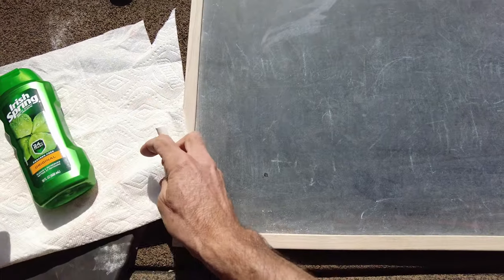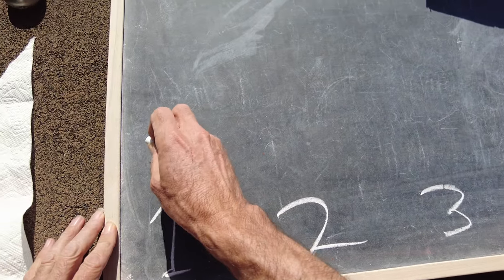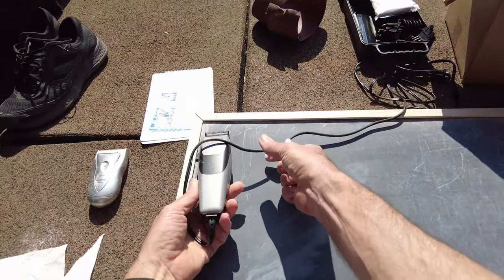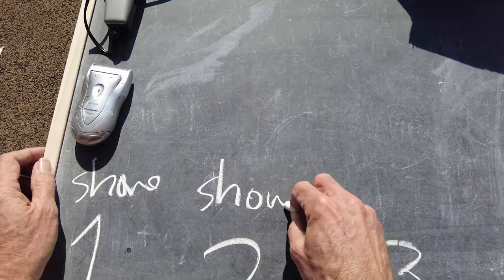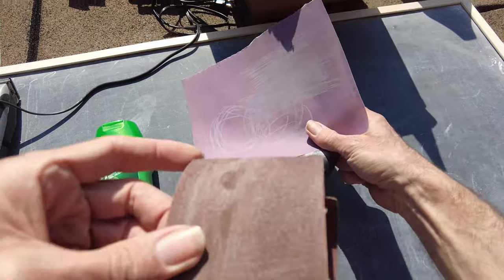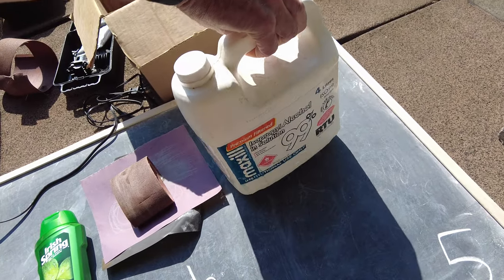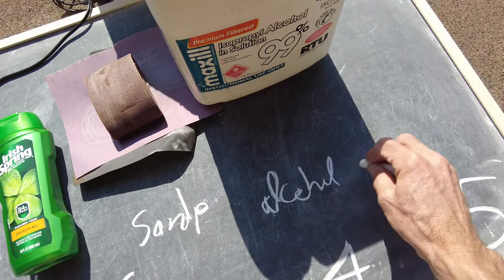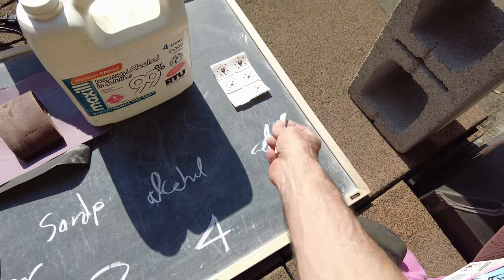So there's five steps to doing a good electrocardiogram. The first step is to shave. Start with a beard trimmer first, if it's long, and then a regular shaver. The second step is to shower, body scrub. The third step is sandpaper. Something nice, like a nice fine sandpaper even works pretty good. There's a couple of different grit numbers here. And the fourth step is isopropyl alcohol. And the fifth step is the electrodes themselves. And then of course you put on the heart monitor after that.